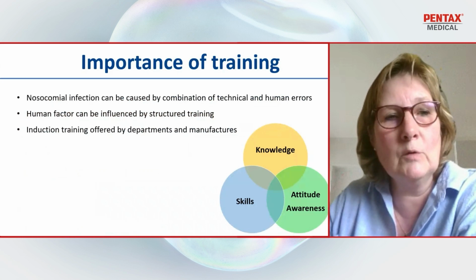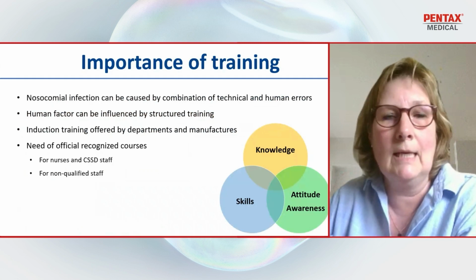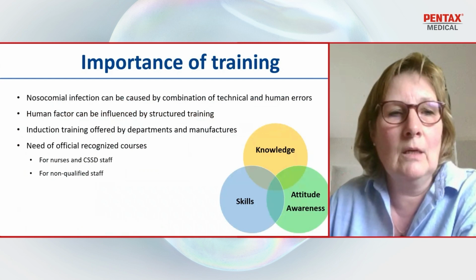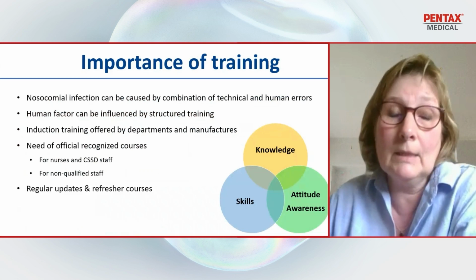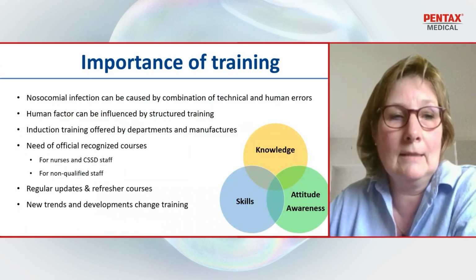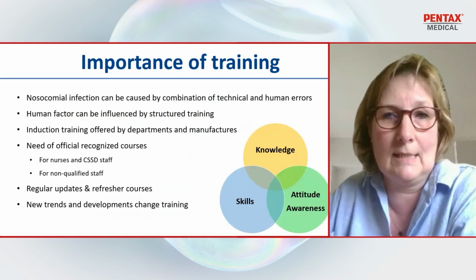And when we get new equipment, we really need a structured induction training program offered by the department and by manufacturers, followed by an officially recognized course, a shorter one for nurses and CSSD staff, and a longer one for the unqualified staff. And we need regular updates and refresher courses from time to time, let's say every 2 or 3 years. And the new developments release our workload and make our work easier, but nevertheless, training is necessary.